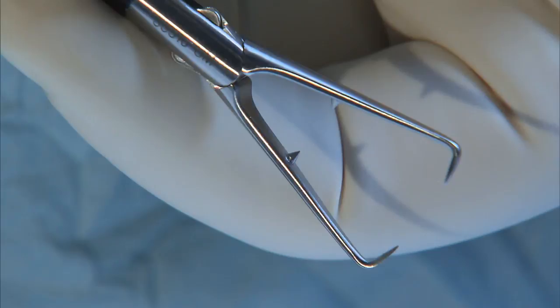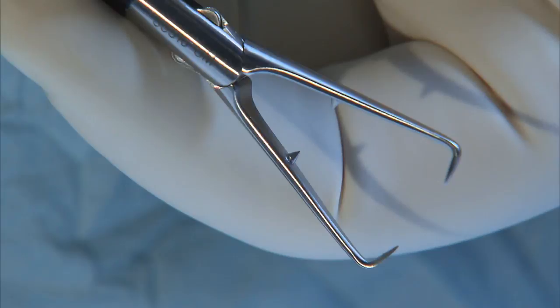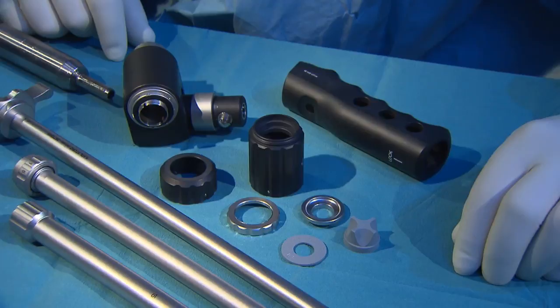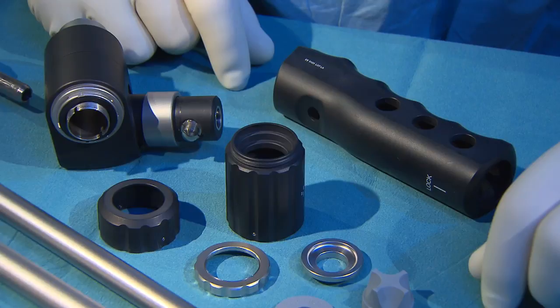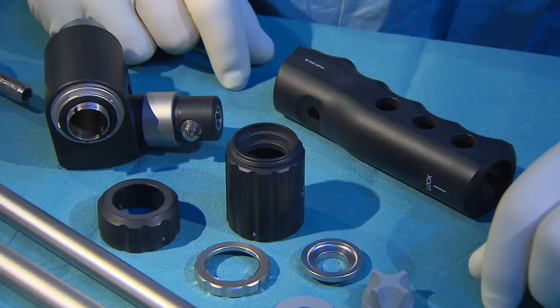The supercut morcellator system can be completely disassembled. All the elements in this system have been completely redesigned. Step-by-step assembly of the morcellator is demonstrated in the following.